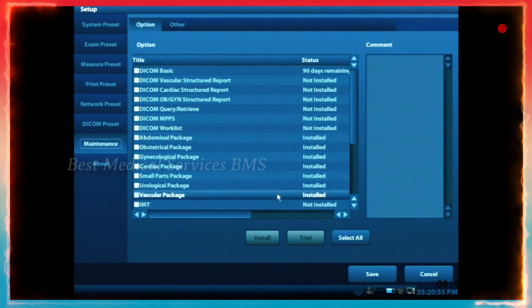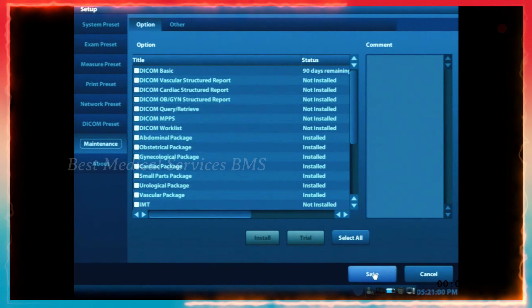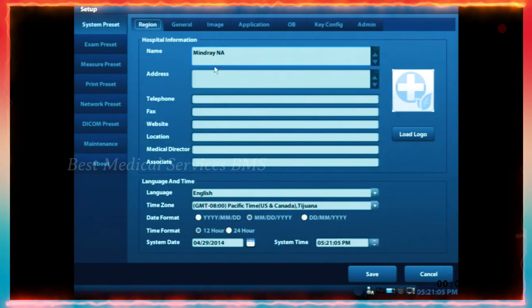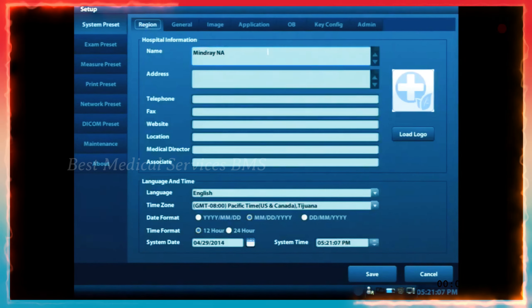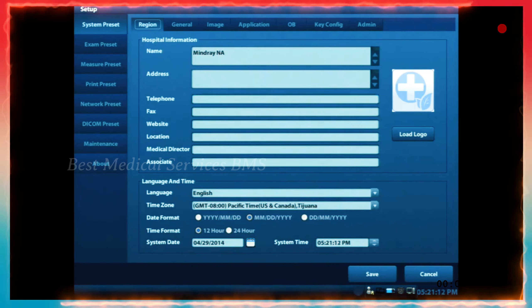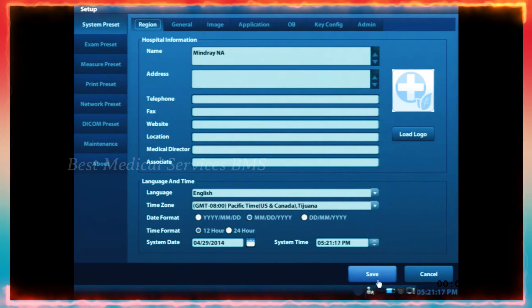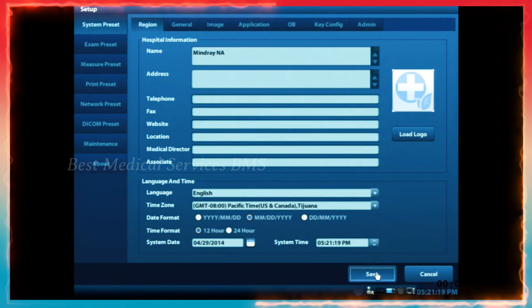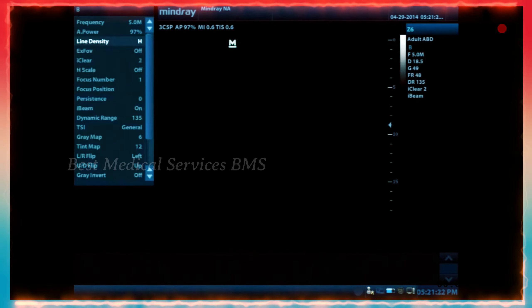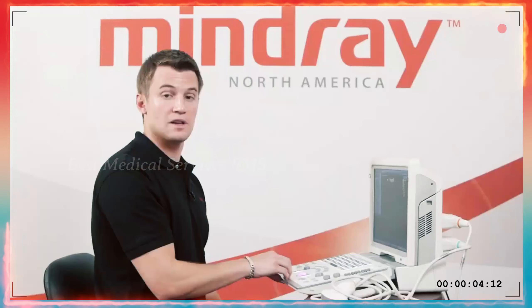I can't stress enough that you want to click save anytime you've made changes. Without clicking save, things like your facility name and system preset settings will not be saved. Sometimes you make changes and forget to press save, so make sure you go down and click save. Then once you're done, it'll take you back out to the setup screen and you're back to your B-mode imaging screen, ready to go.